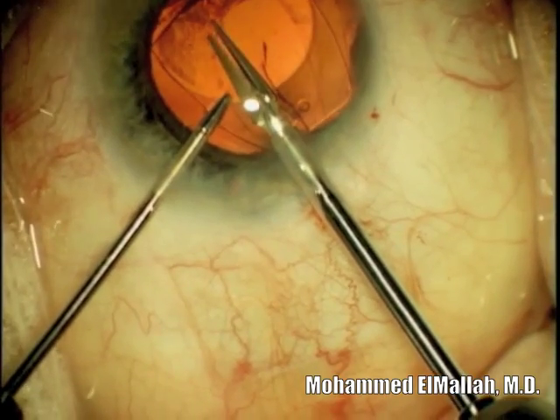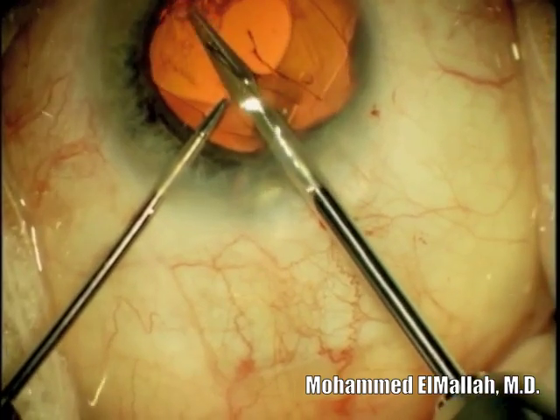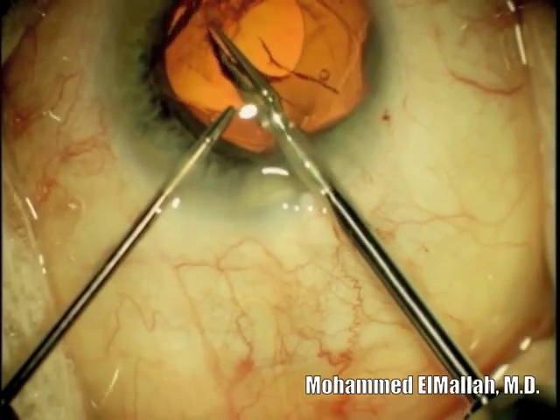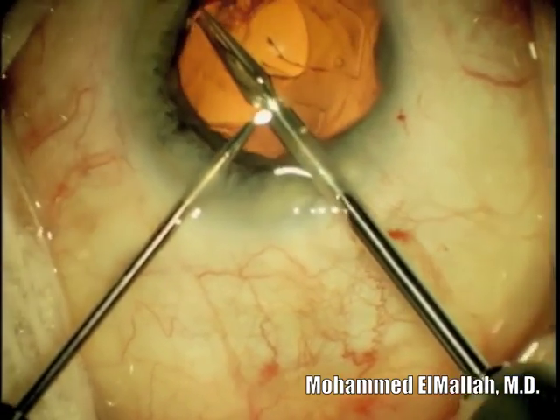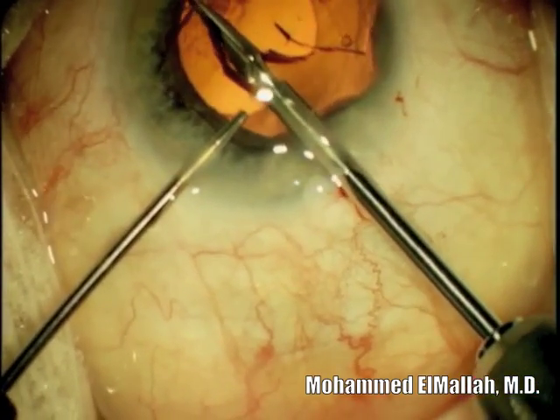Once this fragment has been cut in half, care must be taken that neither piece falls through the opening in the posterior capsule. Therefore, our next step as we complete this cut through the intraocular lens is to have viscoelastic injected behind the IOL fragments.